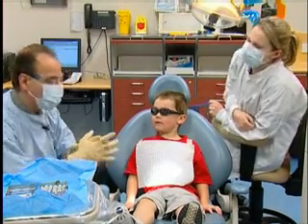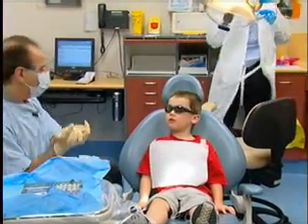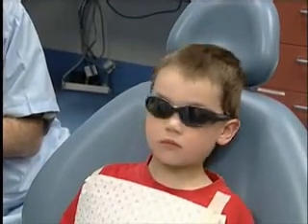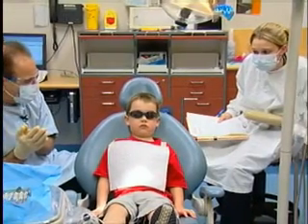3? Okay. Well, what we're going to do is count your teeth and tell you how many you've got, okay? So the first thing we're going to do is put the chair back. Would you mind doing that? Okay, I'm going to press my little magic button here, and the chair's going to go back, but slowly. All right? So you just lay back there and follow the chair.